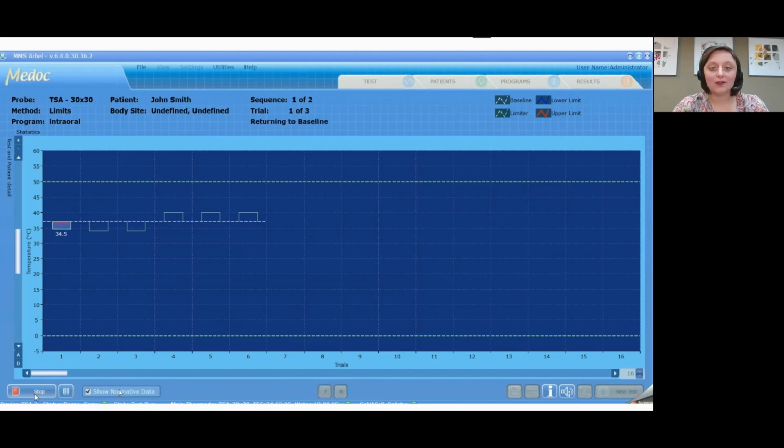We're used to seeing 32 degrees as a baseline temperature, and it is true for the skin, but remember that the testing here is done inside the mouth. So the neutral temperature is not 32 anymore, it's 37 or 35. There are different papers using different baselines. Here in this case, they used 37. They repeated the cold stimulation 3 times and the warm stimulation 3 times, and asked the patient to press the button when they first feel cold and then when they first feel warm.